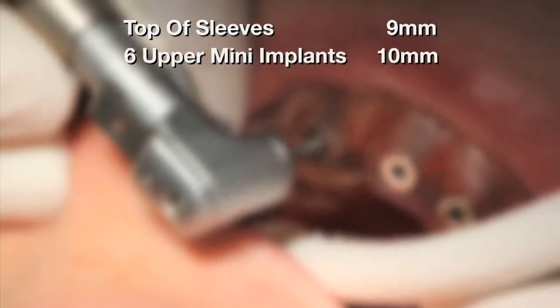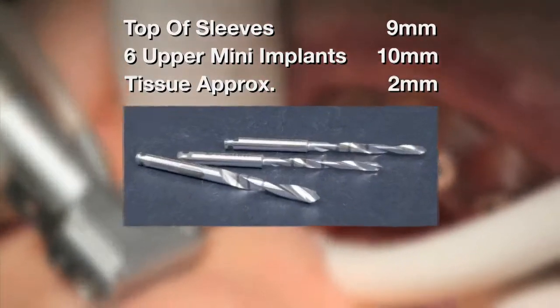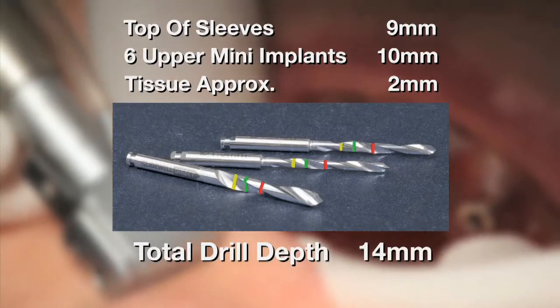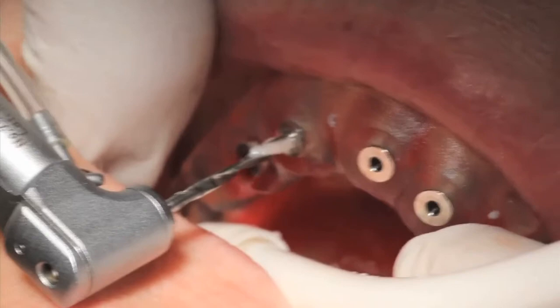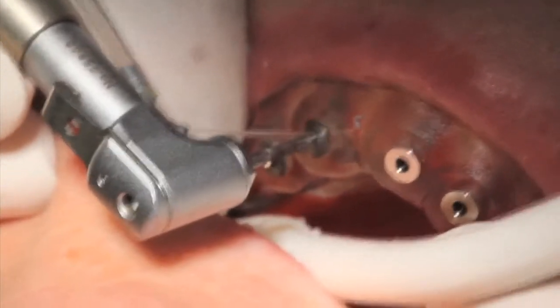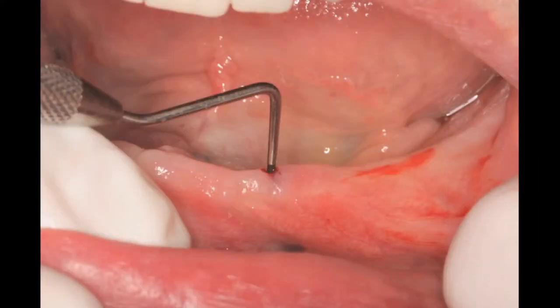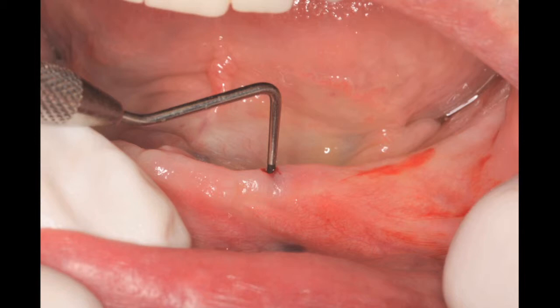In this case, the six upper mini implants were all 10 mm in length and the tissue is approximately 2 mm. The 1.5 mm twist drill has markings at 10, 13, and 15 mm. The total drill depth was 14 mm — one half the length of the implant plus 9 mm. The drilling process was conducted under copious irrigation on a Novak MD-20 at 1,250 RPMs. It is important to minimize tissue damage and thermal trauma to the bone. All six pilot holes were made following the same process and the surgical guide was removed. A periodontal probe was used to confirm that all the pilot holes in the cortical bone did not perforate in the buccal-lingual direction.